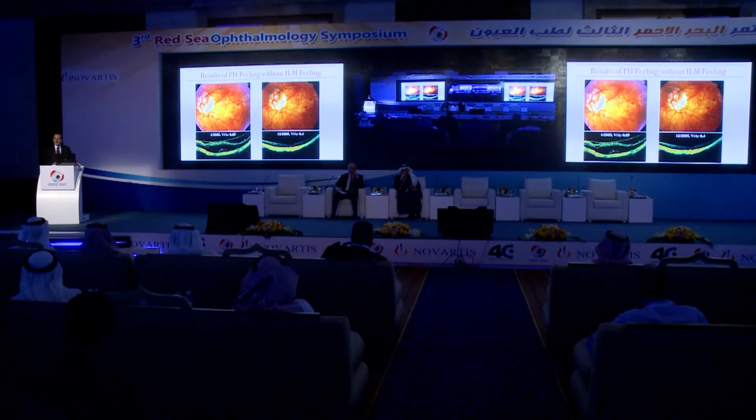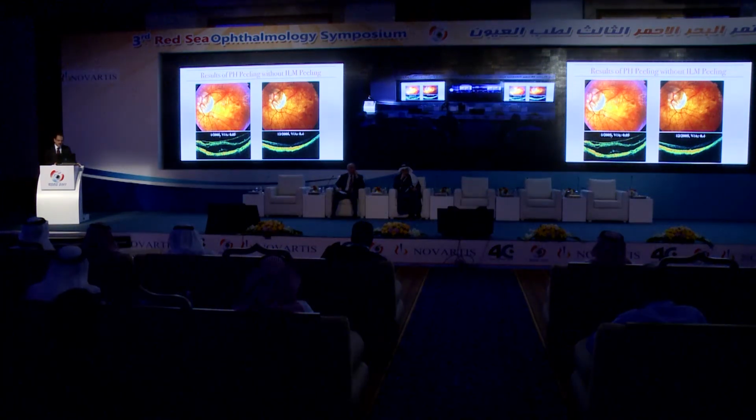What about the results of peeling only the posterior hyaloid? This is the case that was operated upon in 2005, only peeling the posterior hyaloid, and this is the post-operative picture with complete retinal reattachment of the myopic foveoschisis and functional improvement. This is another case who underwent only posterior hyaloid peeling, and there is closure of the lamellar macular hole and settling of the myopic foveal schisis, improvement in the visual acuity.